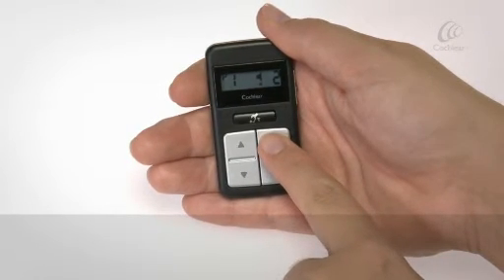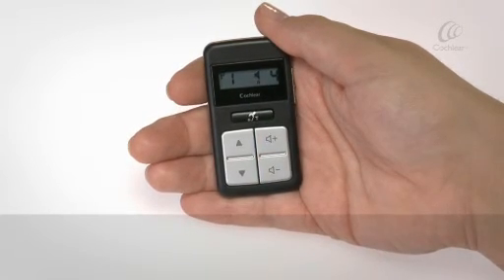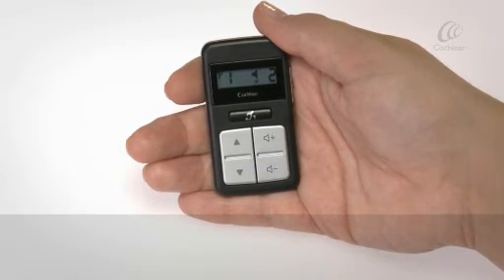Press the plus button to turn up the volume or sensitivity. Press the minus button to turn down the volume or sensitivity.